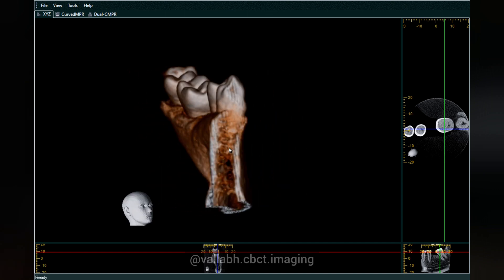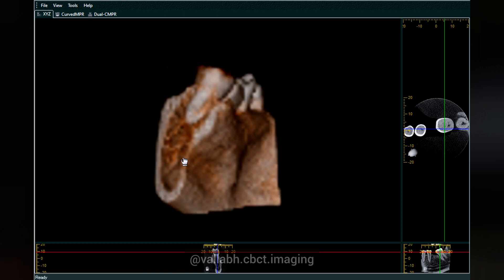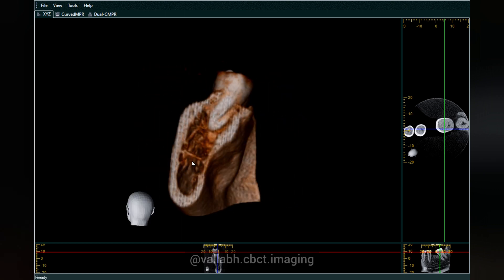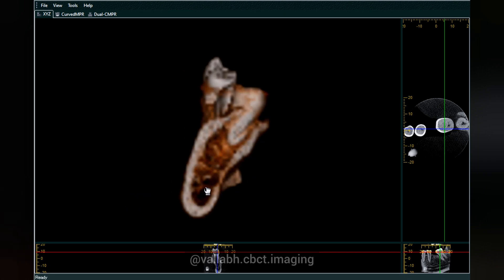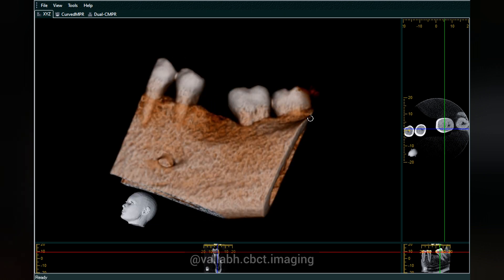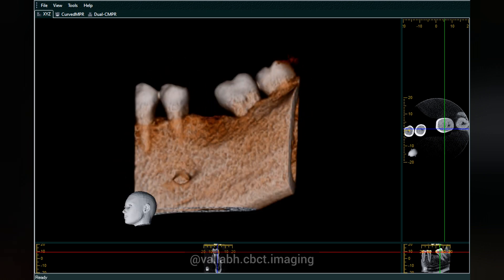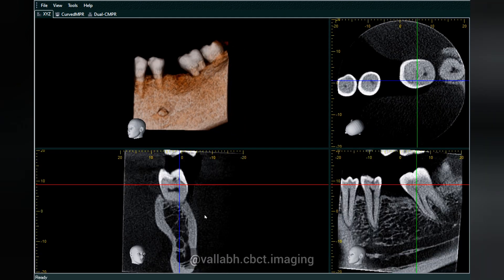This is the bony trabecular pattern as seen in the CBCT. It is recommended to view it in grayscale images, but you can still see it in the 3D volume as well. Now, coming to the anatomical landmarks, we can section or divide the tooth into two pieces.